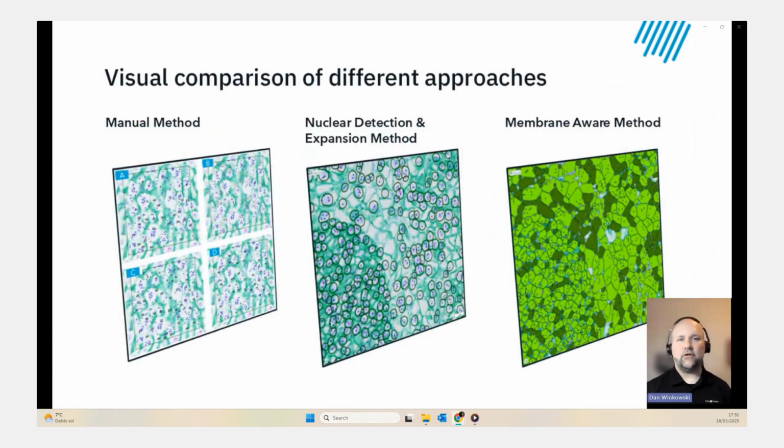Okay, so here I'd like to start wrapping up my talk with a visual comparison of the methods we discussed today. If we just go from the image on the left to the image on the right, we're certainly advancing from a manual approach to an automated approach for dot detection. In addition, we're moving from an imprecise solution to precise outlines of cell objects in the tissue. And finally, from left to right, we're moving from variable to highly reproducible, right? So all those things are benefits as we move from left to right in this sequence of methodologies.